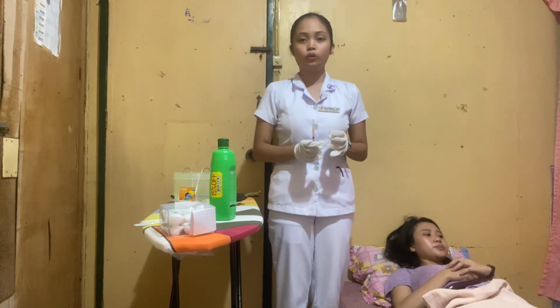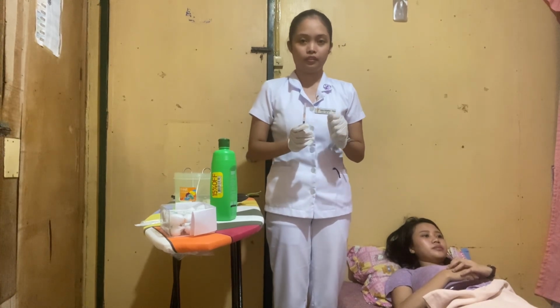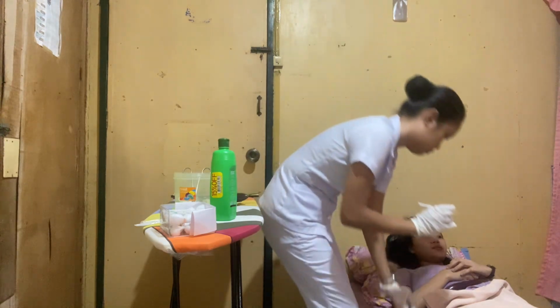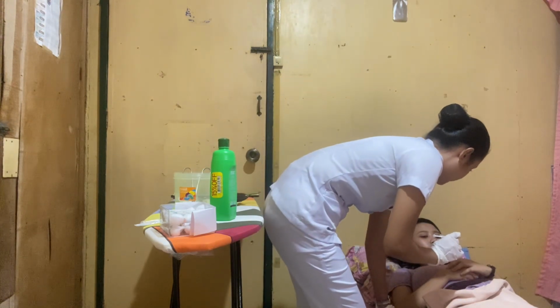Uncap the syringe, pinch the skin, hold the syringe as if you're holding a dart, and then inject the medication into the patient. So we are going to inject the needle at a 45-degree angle. Okay, ma'am, I will inject now.